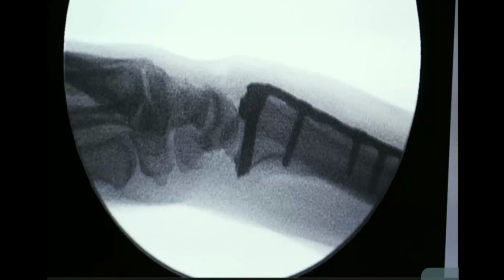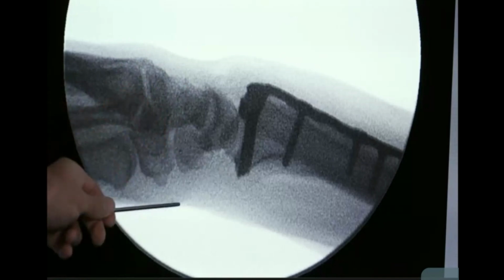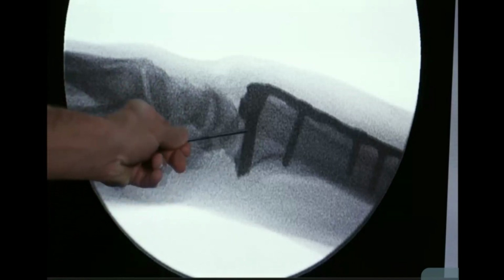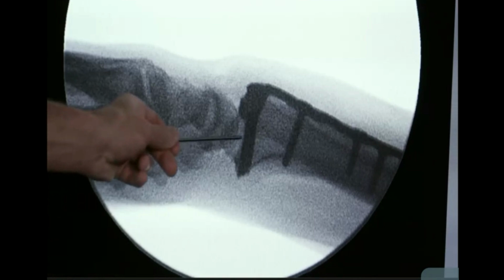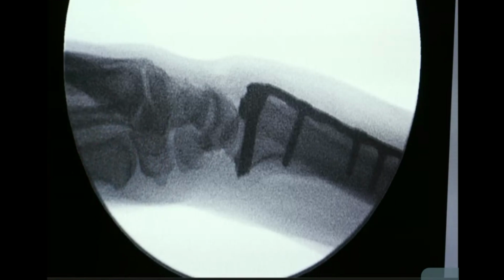Laterally, we can see these screws come down and form a scaffolding right below the subchondral bone. We've got a good idea of this bone coming in there. Same thing as volar. We've got our more radial screws slightly distal. Ulnar screws are slightly back to make up for the inclination of the radius. So lateral-wise, we look good.